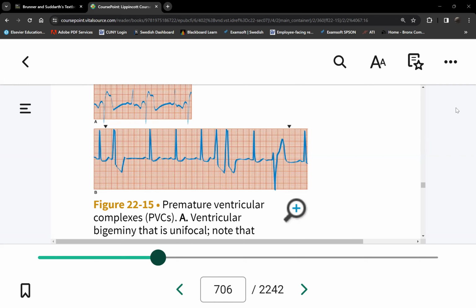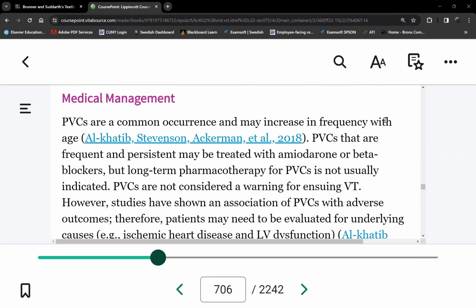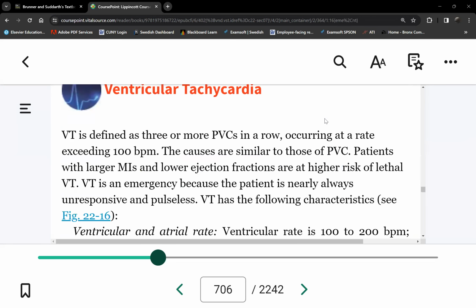Okay, I'm obligated to look at vital signs to see what impact that episode had on the patient's blood pressure. Is the patient symptomatic? And every episode, of course, is serious, because VTAC, what are the two shockable rhythms again? And VFib. Okay, so was it serious? Yes, ventricular tachycardia is a serious rhythm.